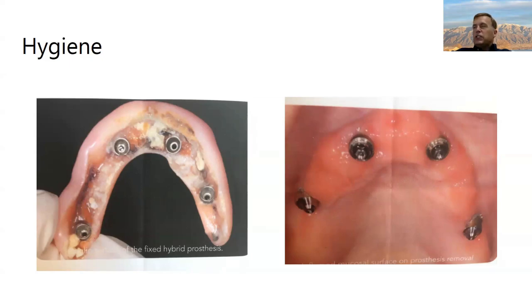And eventually we're going to get hard and soft tissue loss, and we may lose all the implants too. So this is an area where you can help us out in the laboratory by being a second set of eyes, especially on the prototype when we're going to the final. As you know, most of the time the ridge is convex, and there's always that temptation to just come over the edge a little bit. And both we as technicians and you guys as clinicians can push back on it and say, I need that more hygienic, or I'm not going to have the success I need for this case. So I think this is an example where we can each hold each other accountable to get the good results we need.